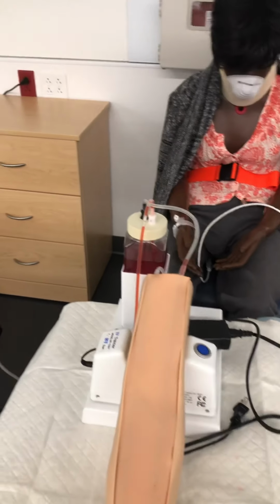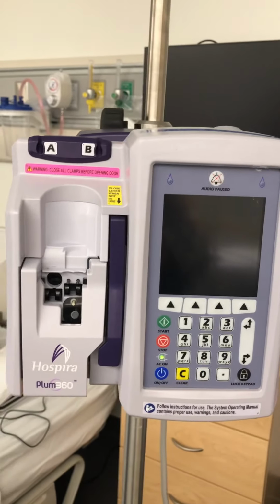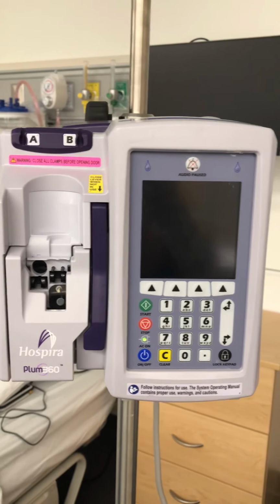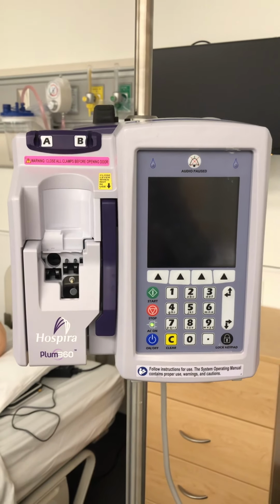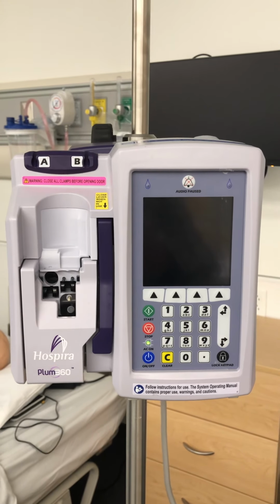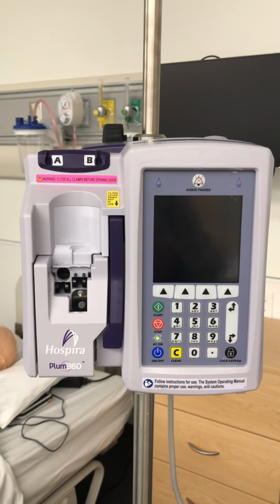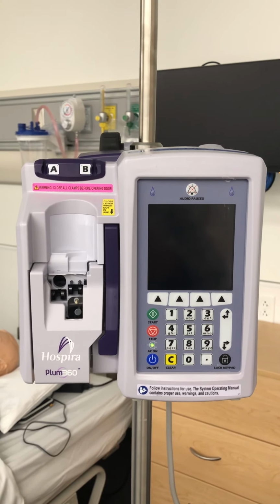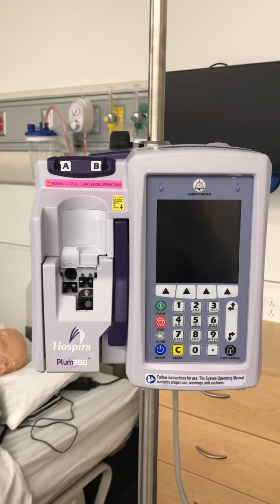We also have here an IV pump. These are the current models that they have at least one of our hospitals in town. We like to try to keep as many things current as we can for the students. This is a way that medication and fluid can be administered, and the pump actually counts the amount so that we're not overloading the patient, nor are we not including enough.